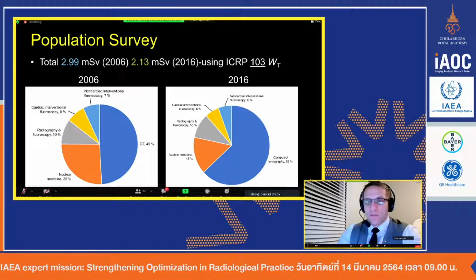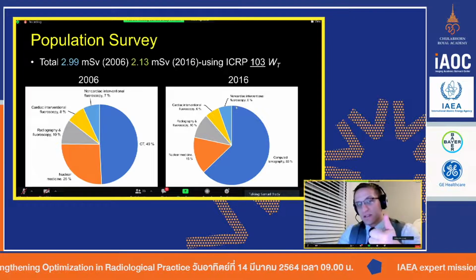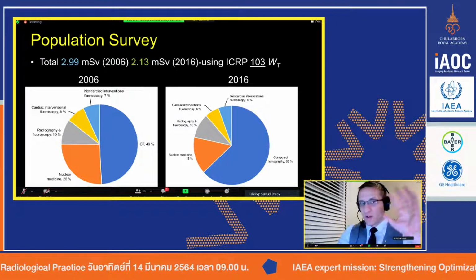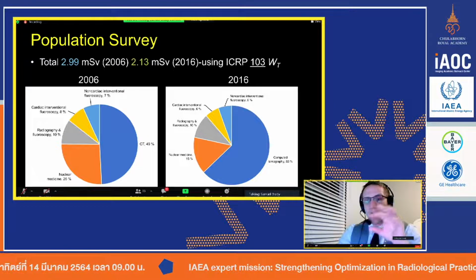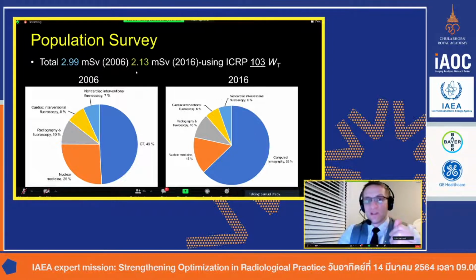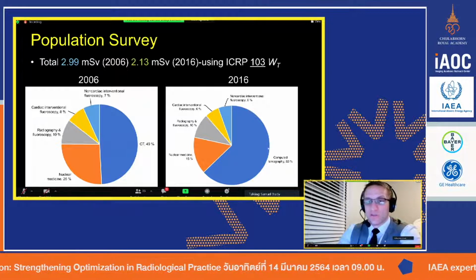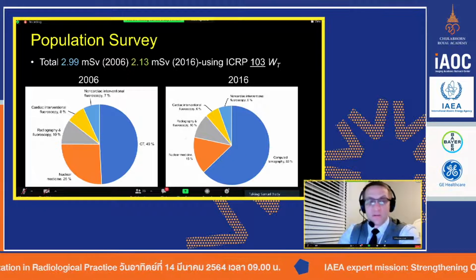And a big part of that is what we're going to talk about today, all of the positive optimization that we have done, like we've talked about already in the last hour, and we will now talk about. All of those efforts that have been put into place for about a decade have paid a huge dividend, have reduced the overall population dose, even though we're using imaging more. So one would argue we're imaging safer now.